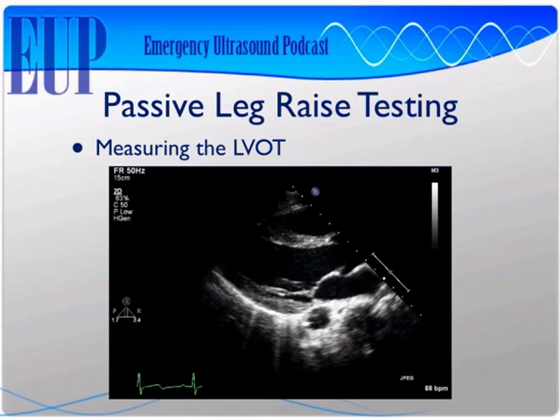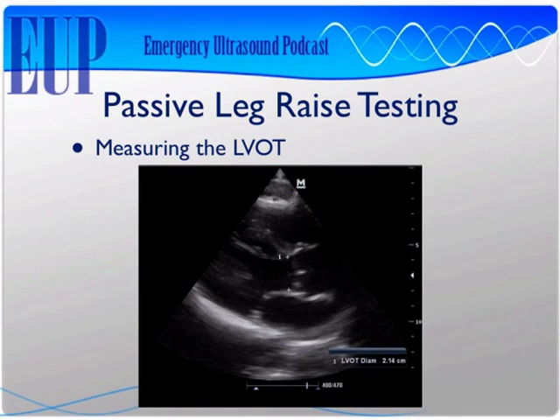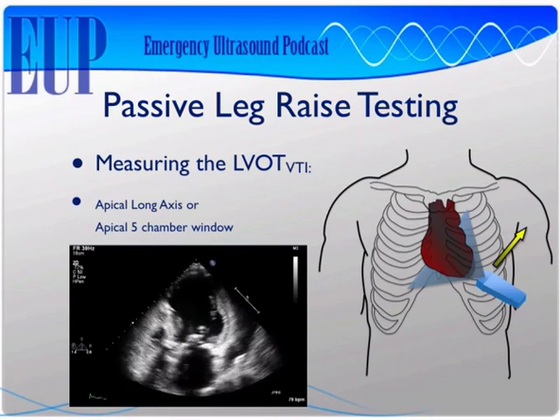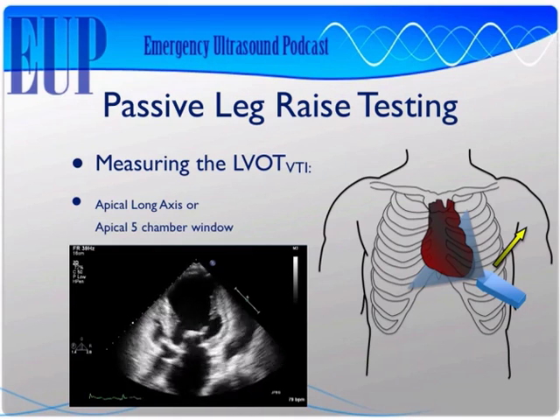Here, we're in the mid-systolic ejection period. I'm going to measure right there, right in between those two aortic valve leaflets, just where the aortic valve leaflets insert into the left ventricular outflow tract. That's called the aortic annulus. Here's an example of measuring the LVOT diameter, and here we've measured the diameter to be 2.14 centimeters. All right, so now we've got the diameter, so that can give us our area.